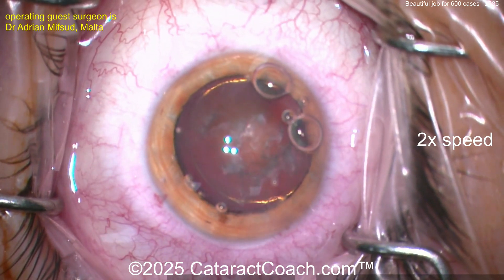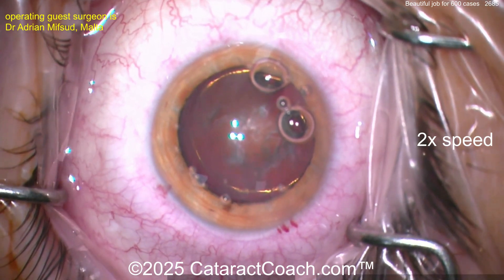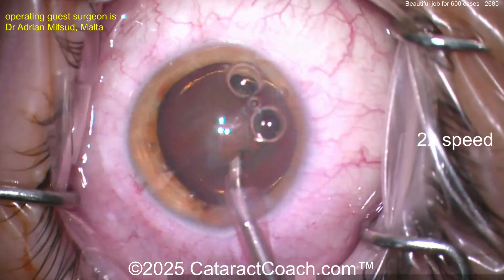Now a little more viscoelastic to coat the cornea, a little more viscoelastic inside the eye to protect the corneal endothelium. Let's see the phaco probe going and let's see the technique — are we going to do a chop? That's my preference, but whatever technique you like, let's take a look.